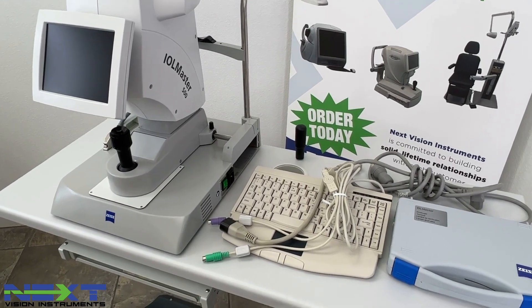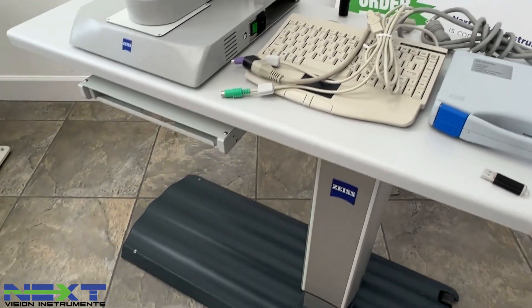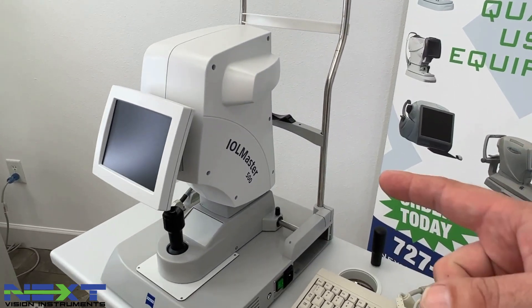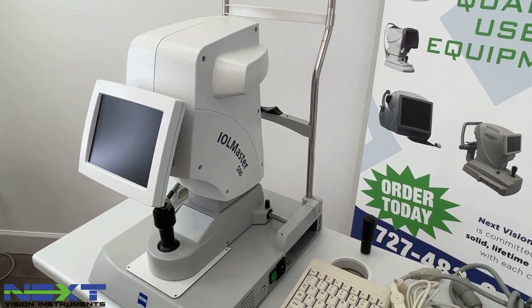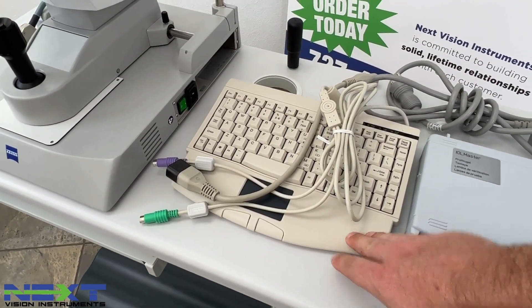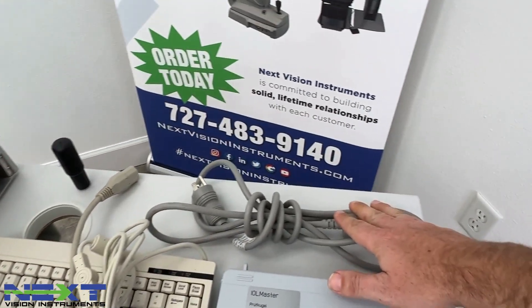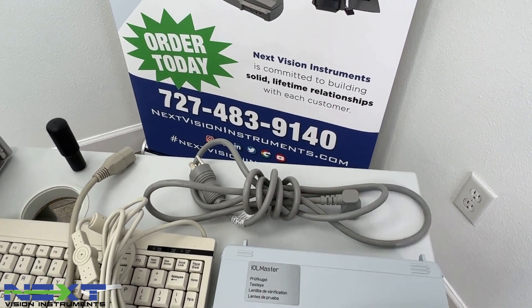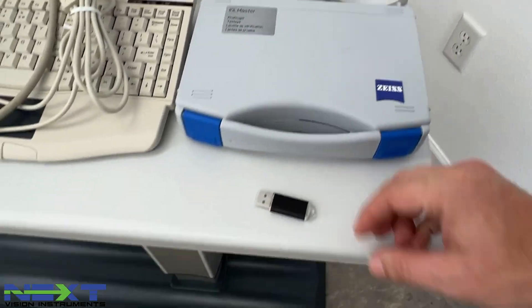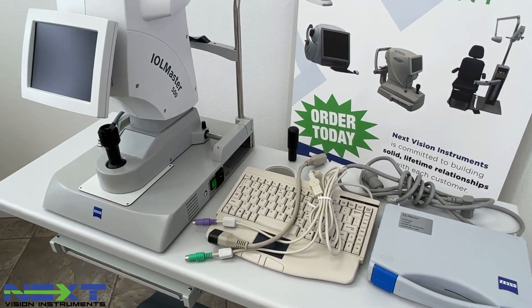Included, the table will come on a pallet — this will be shipped via freight. This is a Zeiss table specifically designed for this unit. You will also get the IOL Master biometer itself. It will come with a keyboard, a cable from the unit to the table, a power cord for the table — because this table is electric, it goes up and down — a test eye, and a USB stick with the user's manual on it for your reference.